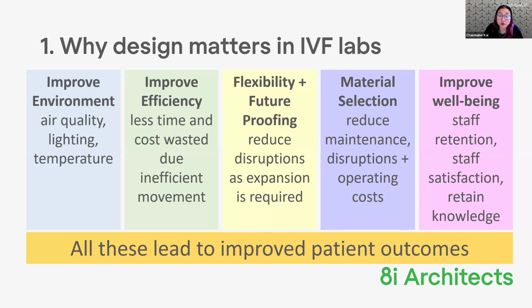Flexibility and future-proofing are very important when you're initially designing a new IVF lab or even refurbishing one, to cater for growth. I've not done an IVF lab in the last 15 years where the lab has not had to grow at some stage.